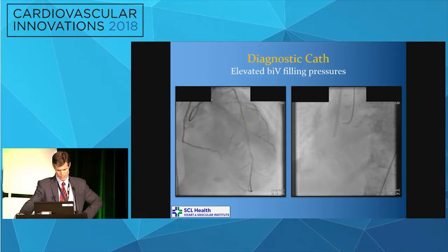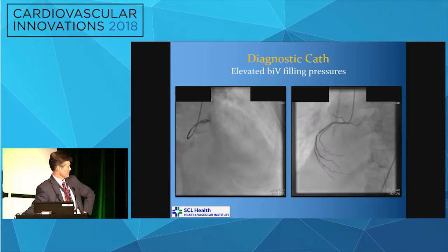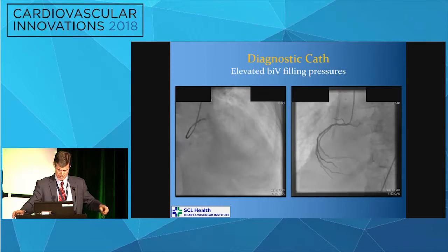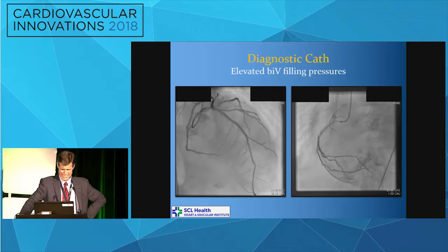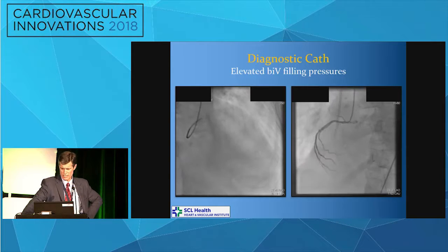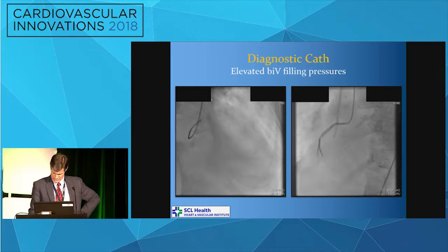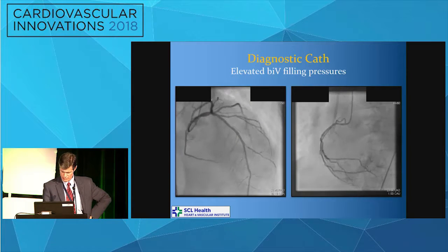Here's coronary angiograms. Probably projected a little bit small, but he's got a little bit of left main disease, but nothing to write home about. There's a patent stent in his proximal circ, and sort of a codominant system here. Fairly large distal circ.